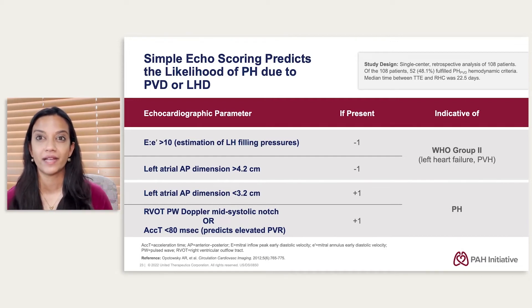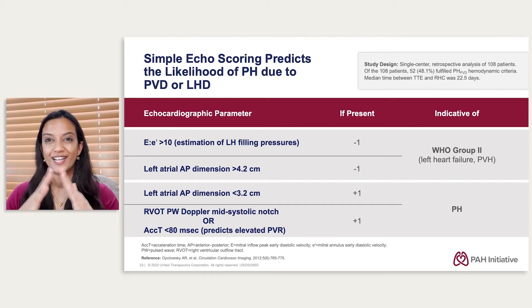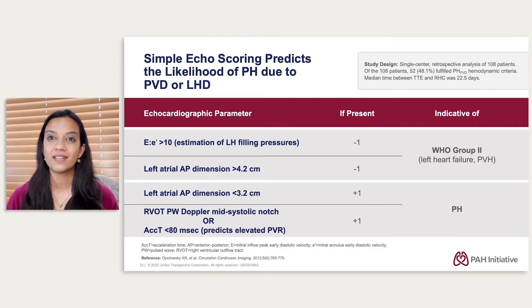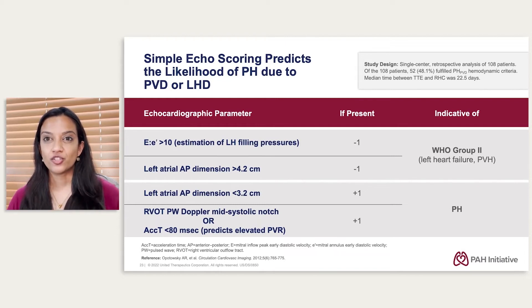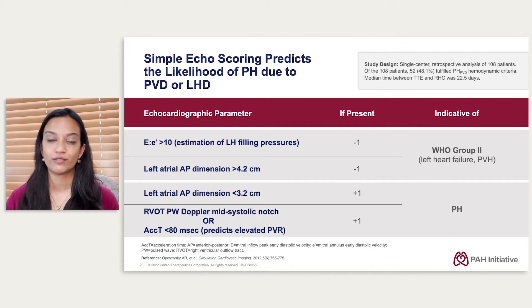That's already a clue that this may be more likely a pulmonary vascular disease problem. Another parameter exists in the pulse wave Doppler in the RV outflow tract. When you eject out of the RV outflow tract through the pulmonic valve in systole and you have a high afterload — a high pulmonary vascular resistance — you get a reflected wave back into the RV outflow tract before the pulmonic valve closes at end systole. That reflected wave causes an indentation or notch in the pulse wave Doppler profile, and it also correlates with a rapid peak acceleration and a shortened acceleration time. The flip side of pulmonary venous hypertension would be these features of PAH: a notch in the RV outflow tract or a reduced acceleration time in the context of a normal or small left atrium.